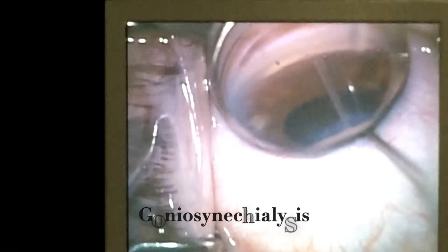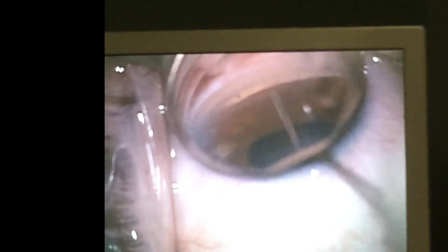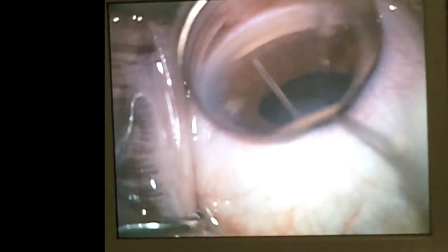Usually synechial adhesions will be present, and these need to be tackled at both the pupillary margin and in the angle. Both can be done using viscodissection, as is being demonstrated in this video.